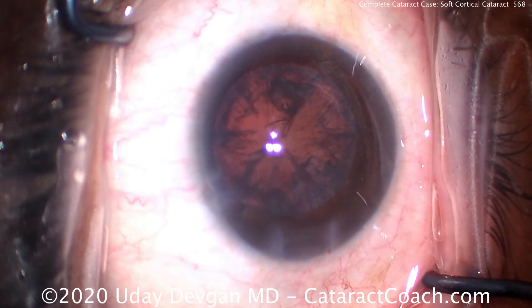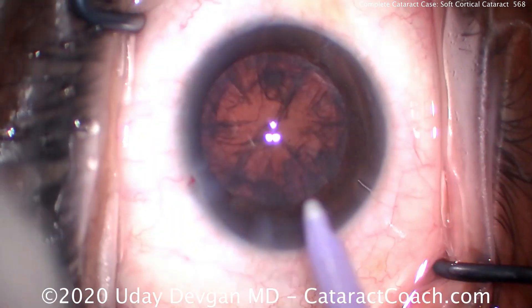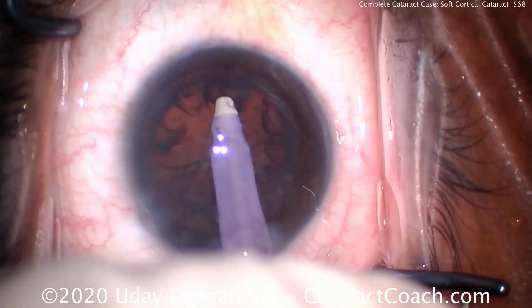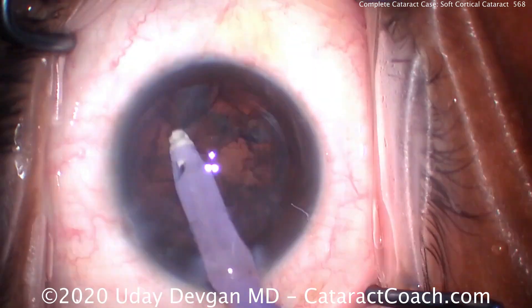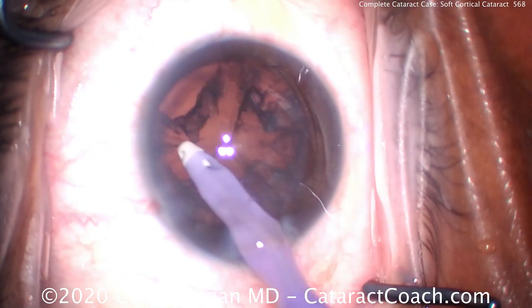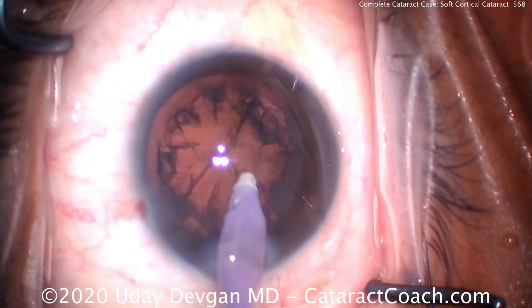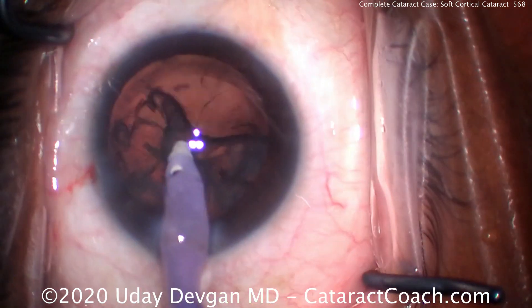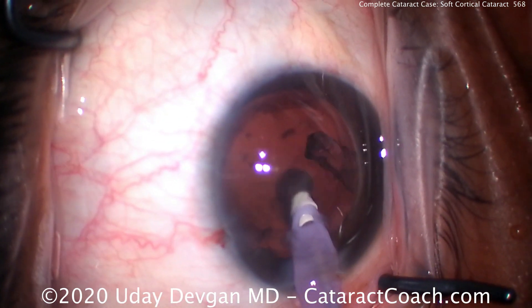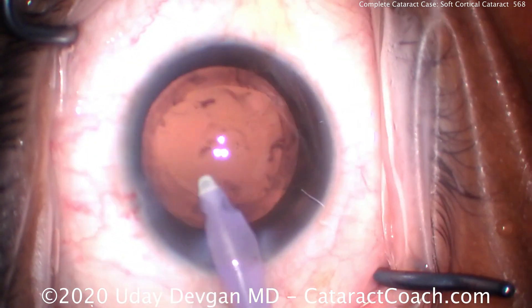That's pretty quick on the cleanup. We'll now go to the IA probe. Unlike dense posterior subcapsular cataracts, cortical cataracts tend not to leave behind material on the posterior capsule, so we should be able to clean this up completely. Taking our time — you can see it's still very opaque, a lot of opacity in this posterior cortical segment. Now we start to see a beautiful red reflex. We'll clean this up and finish the case.